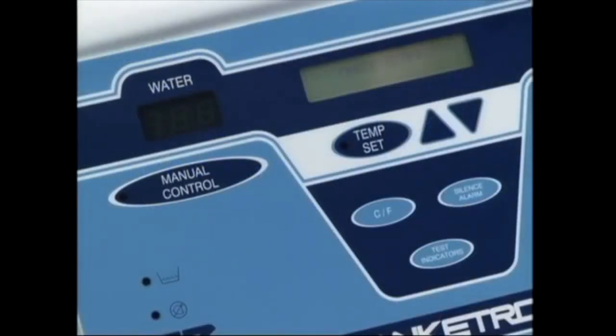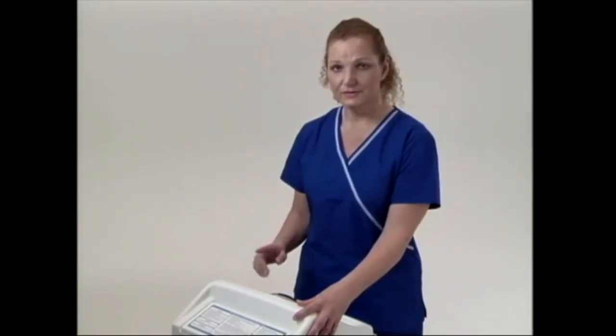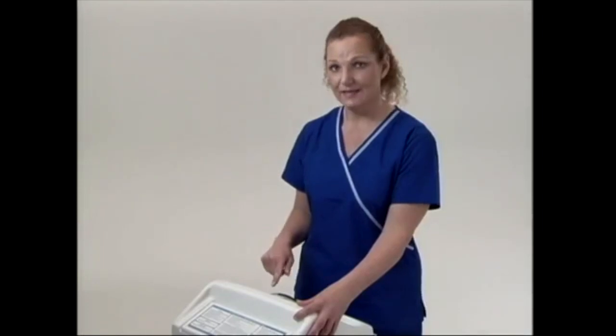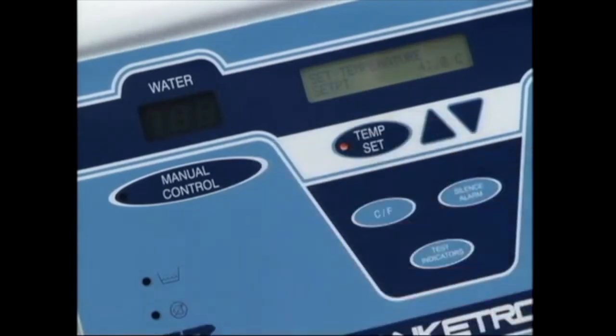To use the manual control setting, all you are doing is controlling the temperature of the water — you are not controlling anything else. To start it, all you need to do is hit the temp set button in the center of the console. Using the up and down arrows, you will set the temperature of the water. When you have reached your desired temperature, hit the manual control button and the water will circulate.